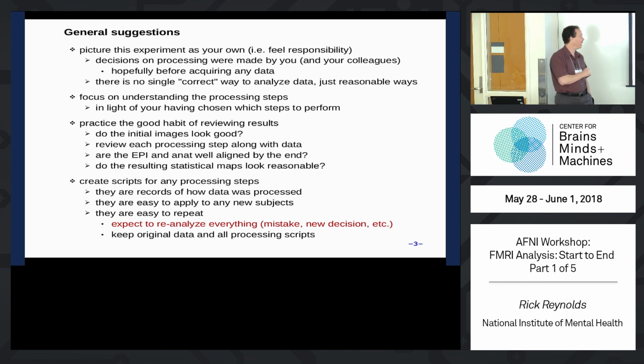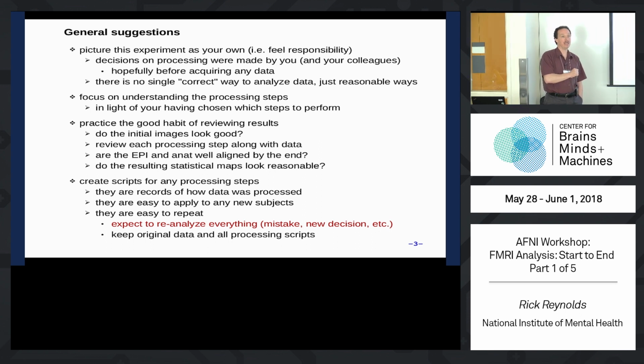Another reason you might have to reanalyze everything: you can start your analysis with a version of the software and continue it for 2 or 3 years as you collect data, each new subject, and then you finally have everyone and you do your final analysis and write a paper about it. But now you're using 3-year-old software. Have we improved in 3 years? I hope so. So maybe you would rather use newer software for your analysis. Maybe registration can be a little better than it used to be. That will improve your group results.